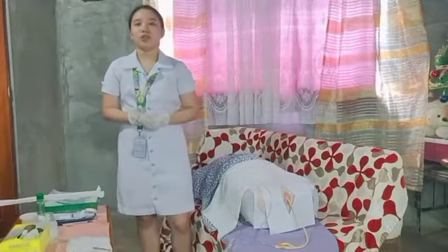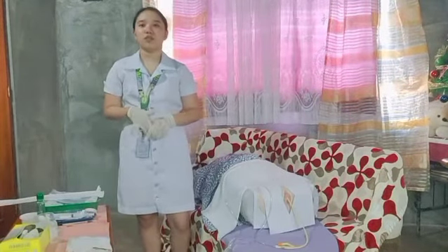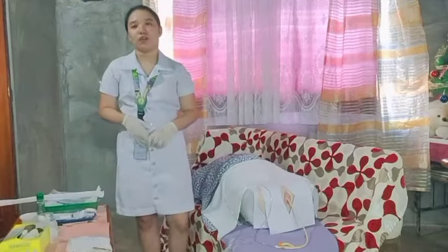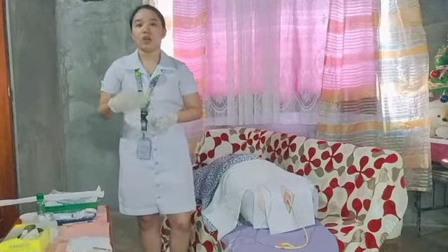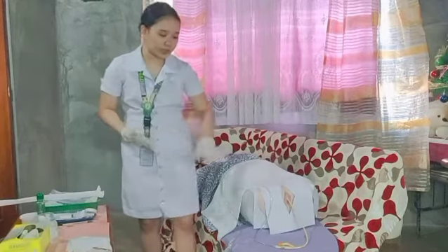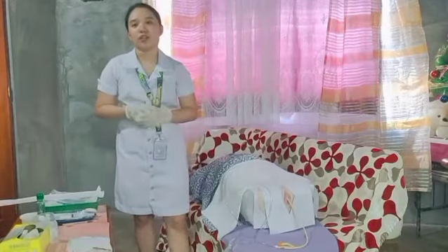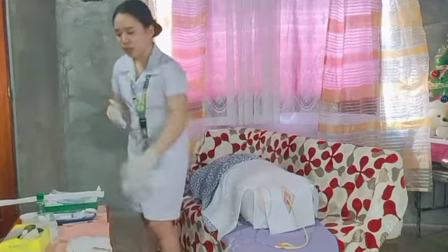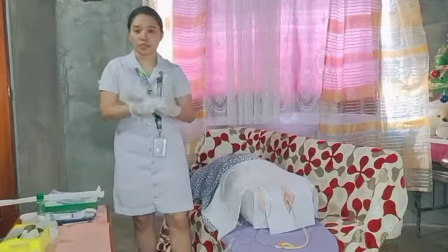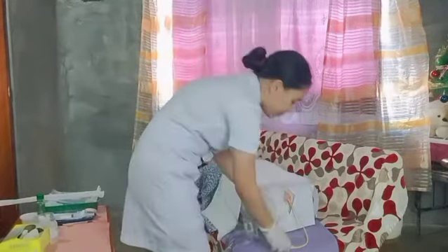Now we are going to collect a urine specimen if required. The rationale, it may be required for analysis or as per agency policy. So ano nga ba yung una natin gagawin? We are going to clamp the urine tube. So let's imagine na nakaklamp na po yung urine tube. And we are going to clean the urine port with wipes and then put the syringe without the needle in the port. So for example, this is the clean wipes. And then you are going to clean the urine port.